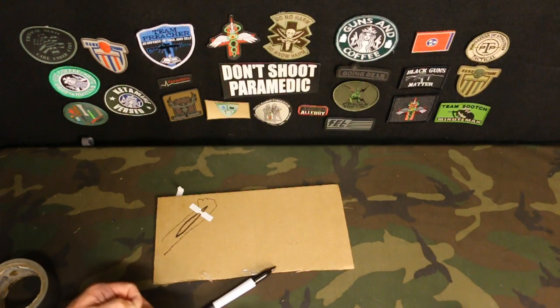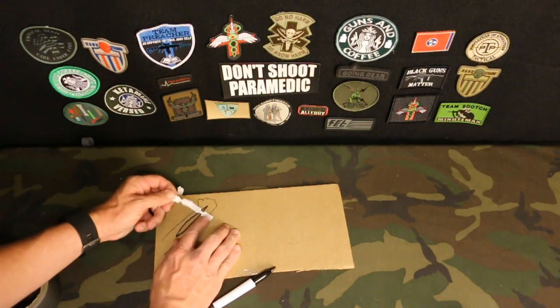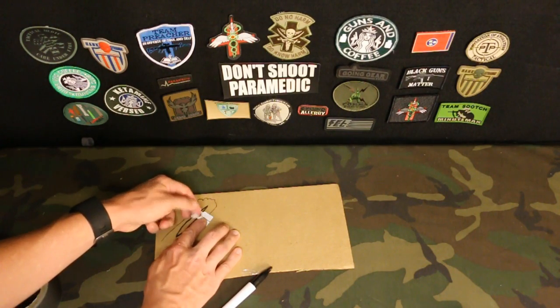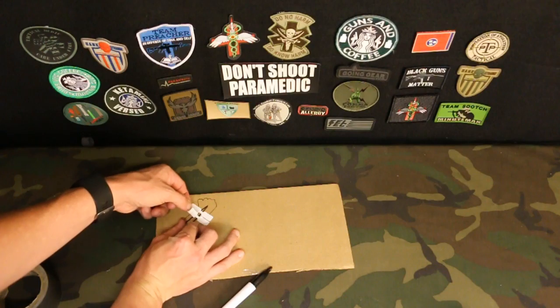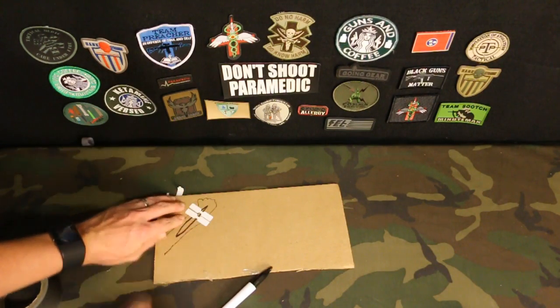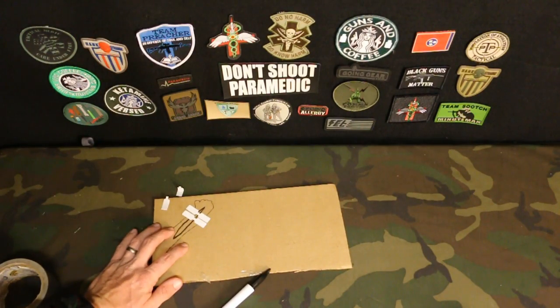So if you've got a large wound, this may take several days to do this because you can't close all at the same time. The body's going to heal from the inside out. So take it, put it on this side, you're going to pull it across, pulling the skin tight, and then rub this on. So we're making this come across here, and so we get all the way across the end of the wound, we can close it up.